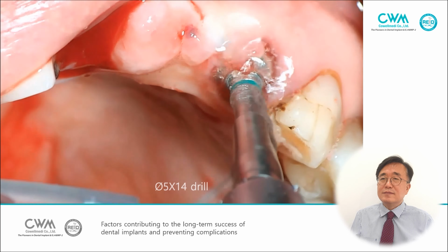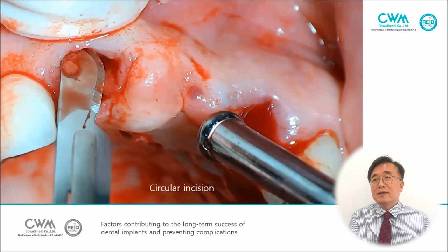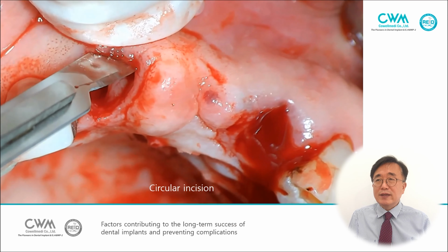You can check the stopper 4 mm level, and then the incision is made and granulation tissue is removed with a blade.